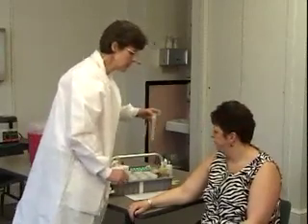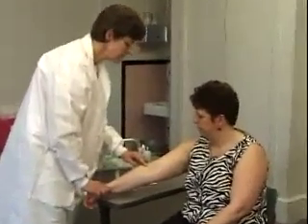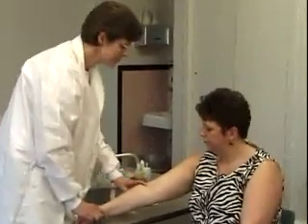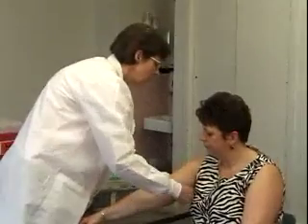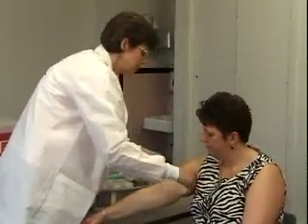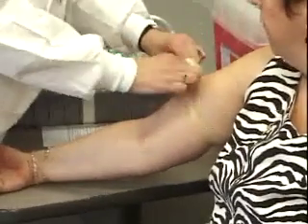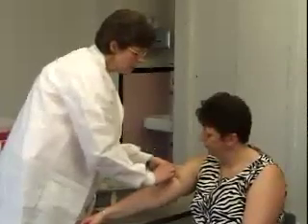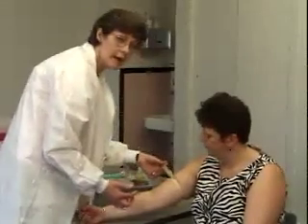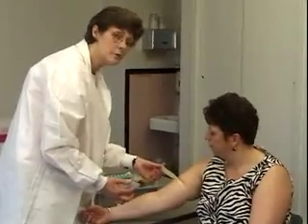The first thing we're going to do is put our tourniquet three to four inches above the antecubital area. This is the choice site that you would want to stick somebody for a blood sample. You want to make sure that you do the loop over the top so that it doesn't hang down in your way, and also so you can release it with one hand, because at the very end of the procedure you're only going to have one hand free to release the tourniquet.